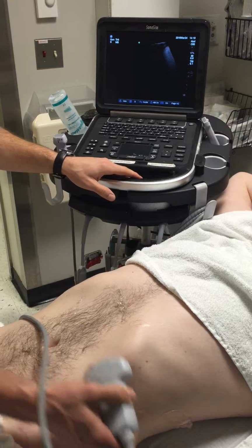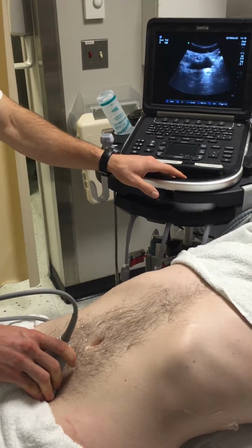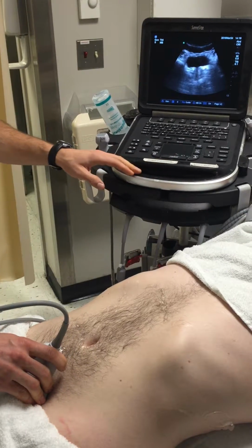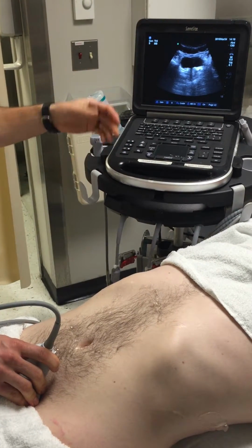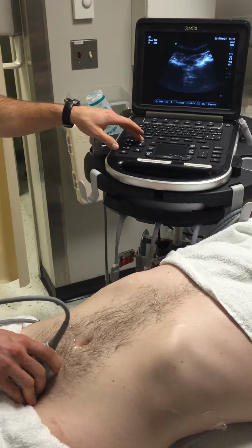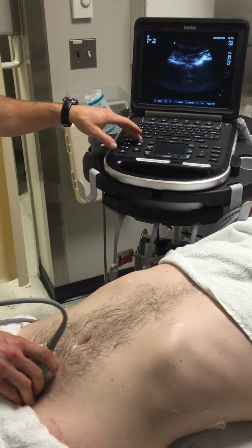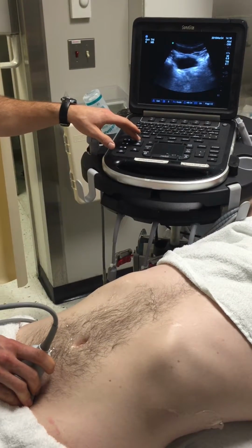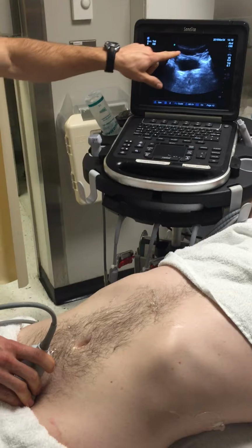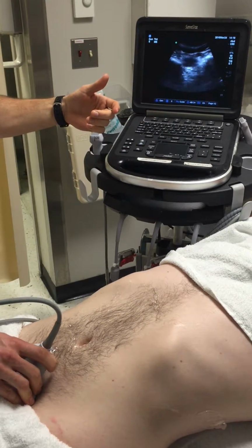And then typically I also finish with bladder view, and sometimes you can see the stones in the bladder or right at the UVJ if you're looking for kidney stones. If you're doing this more for measurement, you can measure for a urinary retention patient or a neurologic presentation. But you can see here is the bladder. There's a small amount of urine in it, and so I fan all the way down, all the way up.